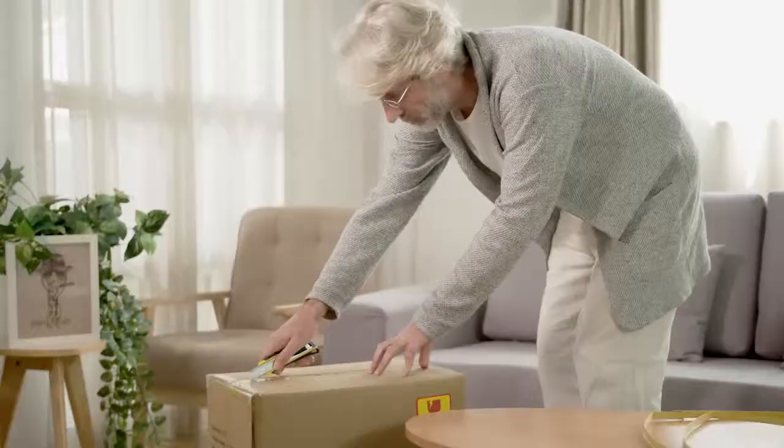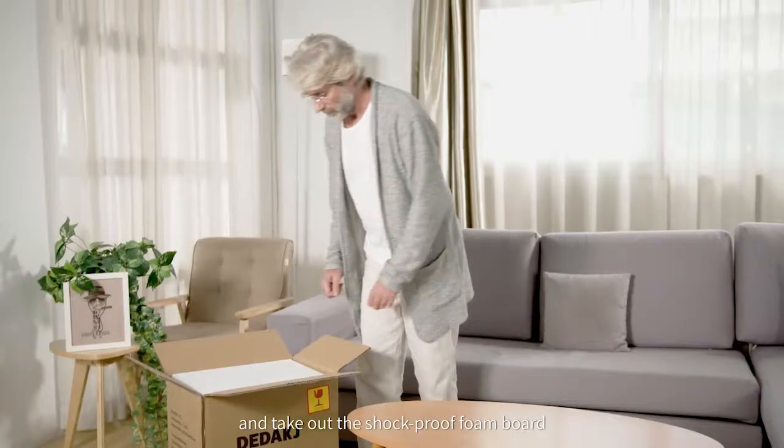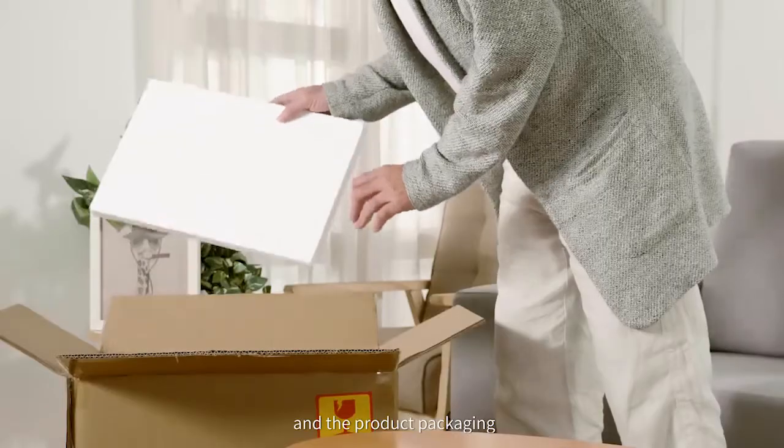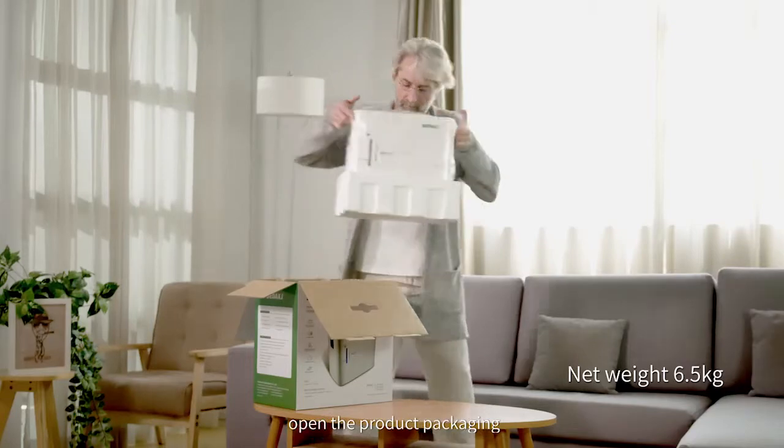First, cut the strapping band. Then, cut the sealing tape and take out the shockproof foam board between the courier box and the product packaging. Take out the product and open the product packaging.